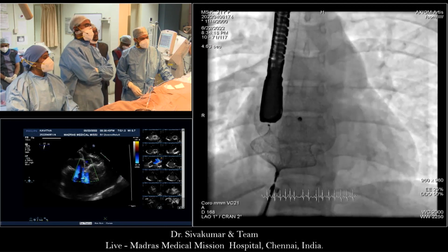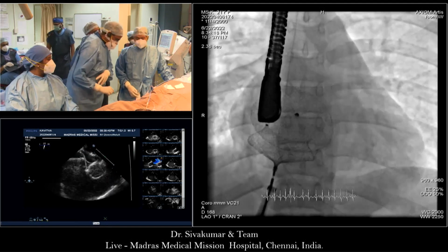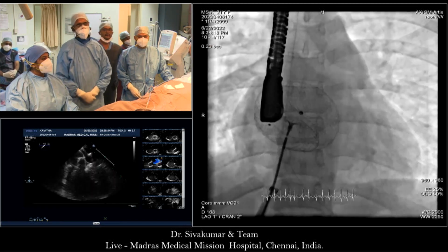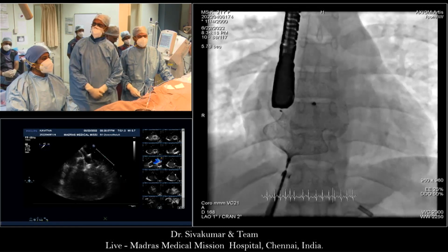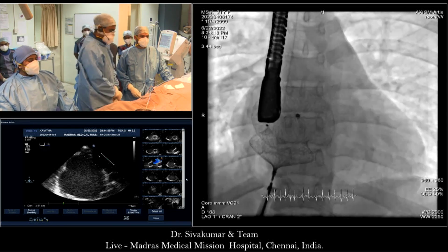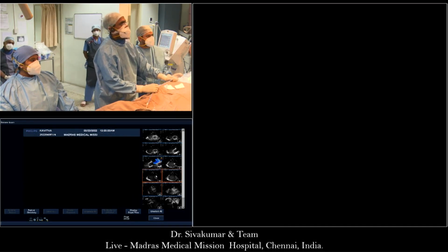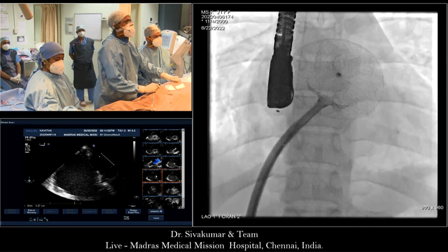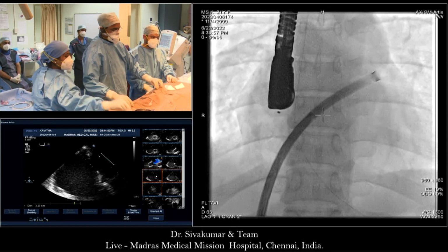You want to downsize? How much do you want to downsize? Shiva, look, we have had some various discussions about sizing. The largest diameter we have had was 32 millimeters. I remember. Yep. I fully agree that with the small rim upsizing is very helpful. Get a Cocoon 36. I do not believe, and that's my humble belief, that the bigger the better. I think a little less would be better in this patient, and I think being a great teacher and with your experience, you would have better success with a device, let's say, not 40 but 36, something like this. I will do that, Nick, now.